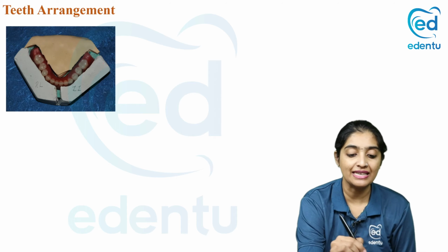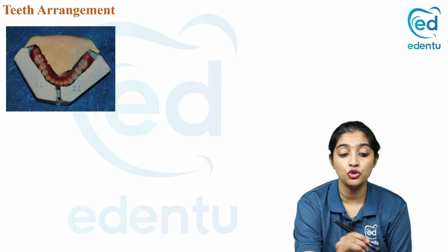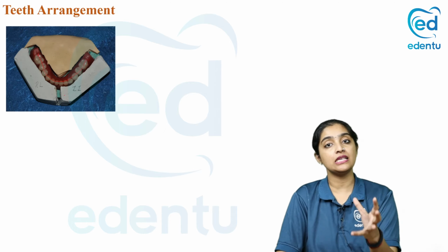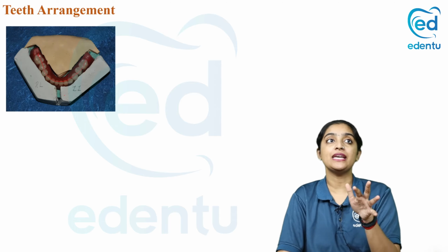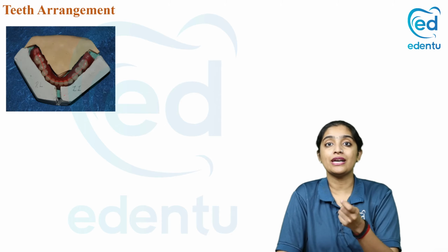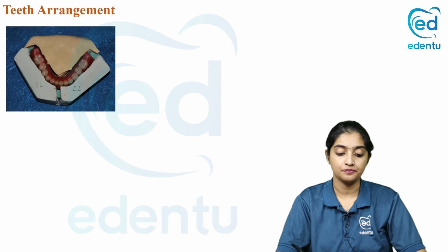When the teeth are arranged in that space, you are placing them in the neutral zone. By placing the teeth in a neutral zone, you are achieving a more stable denture, especially in a knife-edge or very minimal ridge case, where retention is very, very difficult.